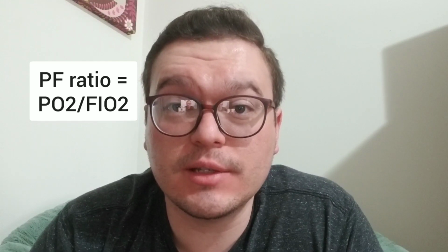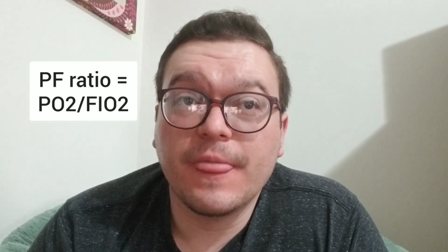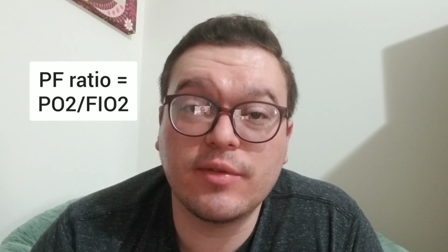If you remember all of those things, which again, those could be separate videos if you guys would like. The best thing that I can advise is that, at least the way that we are treating COVID-19 now, you can look up ARDS tables from ARDSnet where you can titrate PEEP and FiO2 together in obese and not obese patients. Those are very easy things to look up real quick. That'll give you a basic idea, if we continue to treat this similar to ARDS, how to titrate both of them. Understand, like I said, higher oxygen levels do come with a risk of oxygen toxicity.